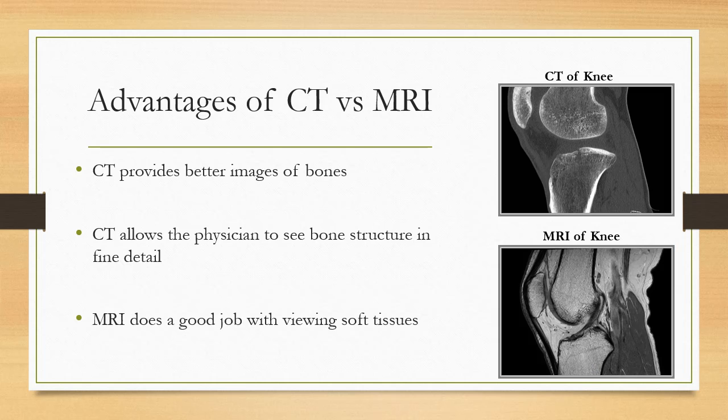Now let's discuss the advantages of CT over MRI. CT provides better images of bones. They allow the physician to see bone structure in greater detail. However, MRI does a great job with viewing of soft tissues.